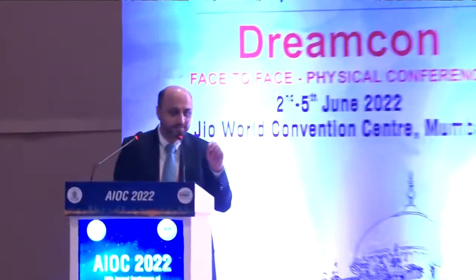First tip is that I think you should do a very good base excision before you put the chandelier, because I've seen that if the base is not cleared, then it illuminates that area too much. That is one. Secondly, I use a superior chandelier and sometimes an inferior nasal chandelier, depending upon where your membrane is. Like these cases obviously had membranes all over, so I use a superior chandelier.